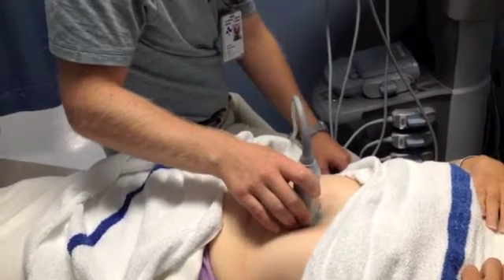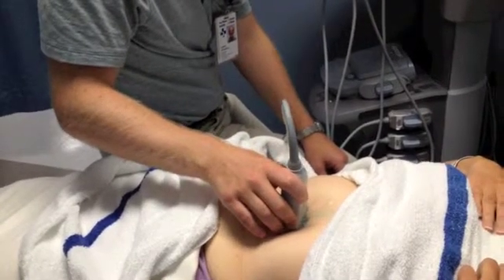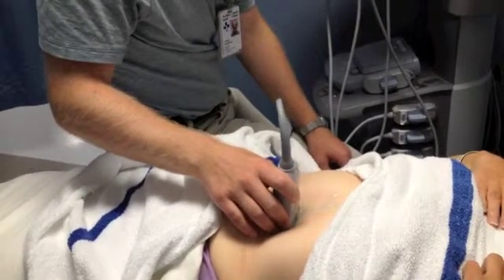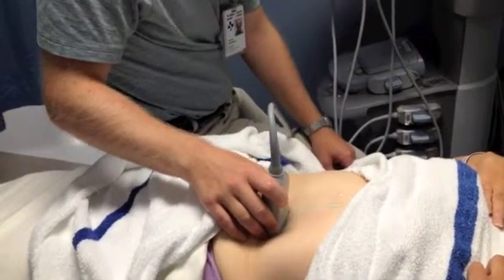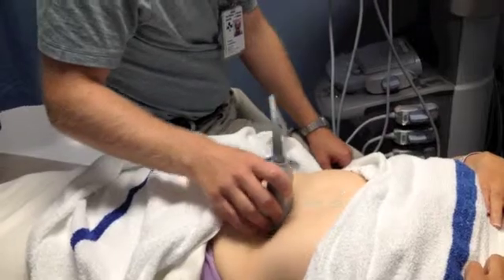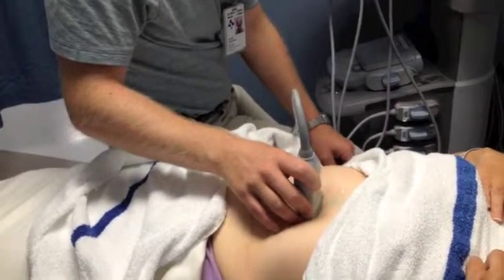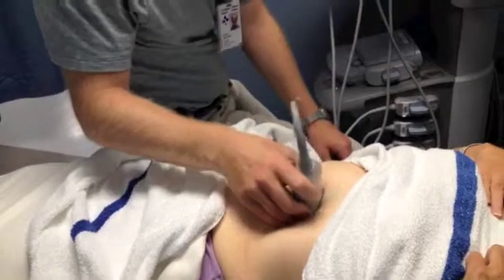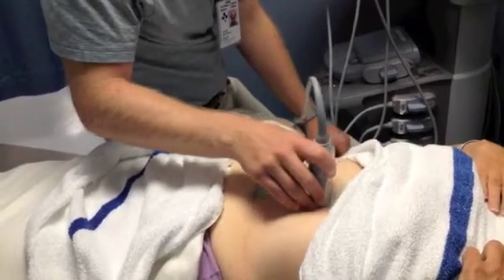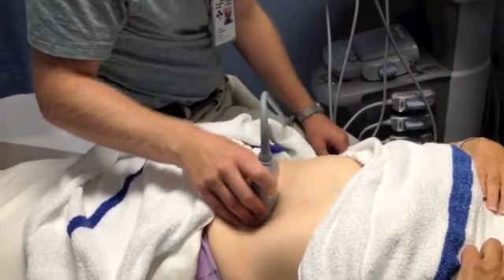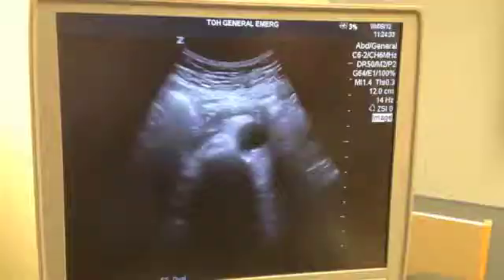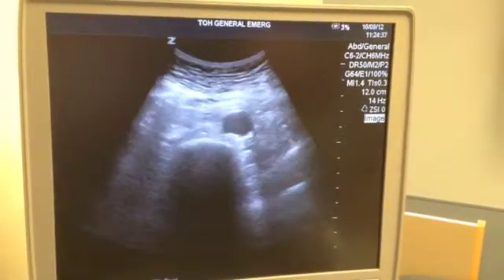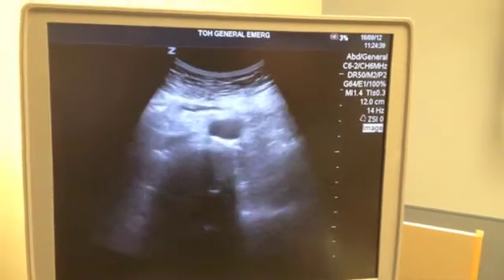Notice as I move, I'm sliding the probe, but I'm not changing the angle — I keep the probe completely perpendicular to the patient. You won't get better images by moving the probe left and right. You want to keep the probe perpendicular to the patient. Now I start following the aorta all the way down.